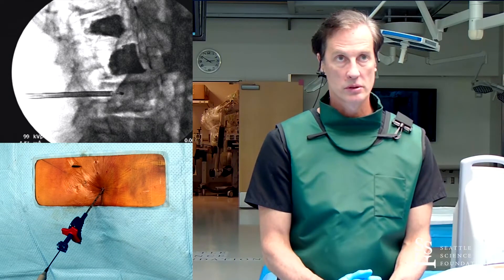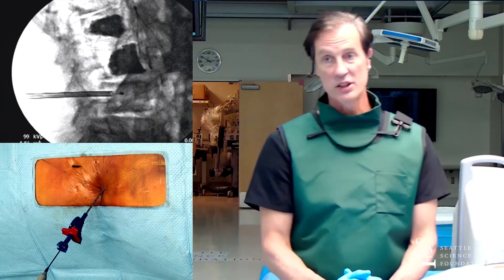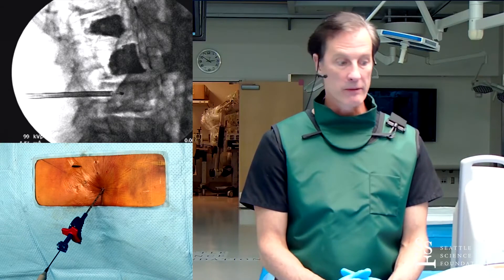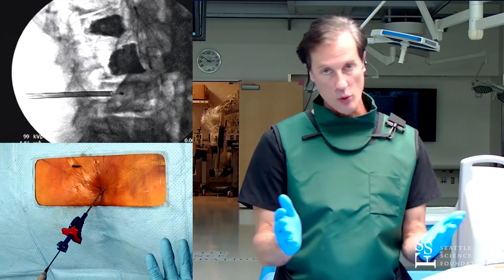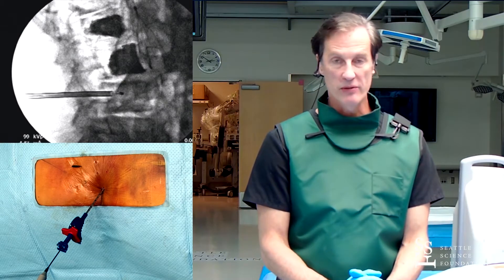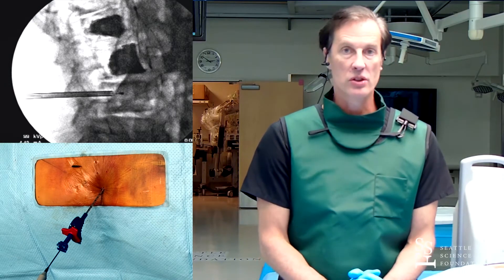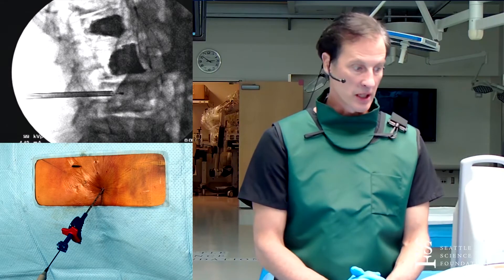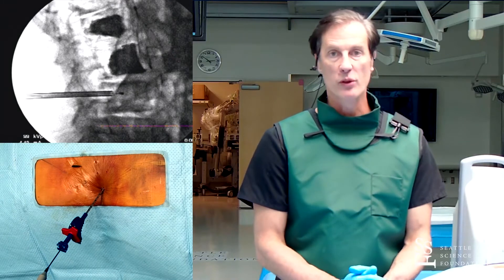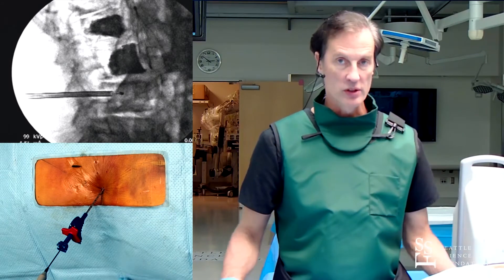Is it done with sedation? Yes, so this is at least moderate sedation. I usually take this to the OR, really because of length of time - two, three, or four burns can take up to an hour to an hour and a half sometimes. My average procedure time is about 50 to 70 minutes, right around an hour. Keeping somebody under MAC or constant sedation for an hour is difficult. This is about like a kyphoplasty procedure in terms of discomfort for the patient, except kyphoplasty is a lot faster. So I actually do these in the OR.